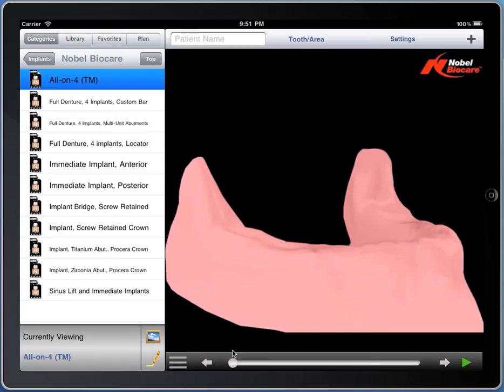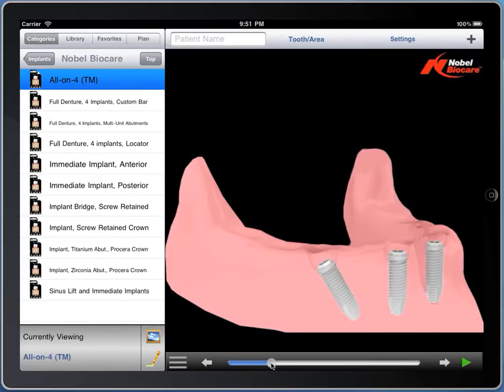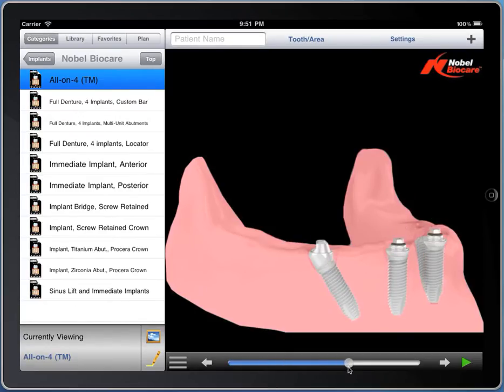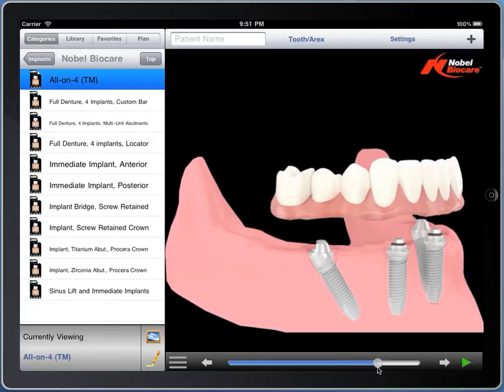So here's the all-on-four demonstration, and as you go through, you'll see the familiar all-on-four implants, abutments, and denture.